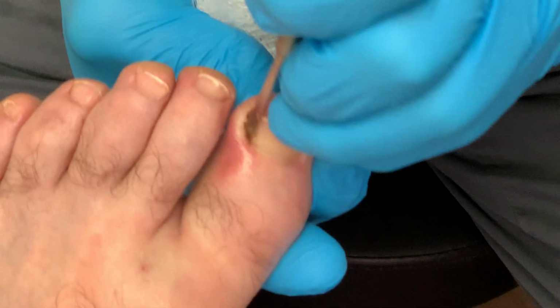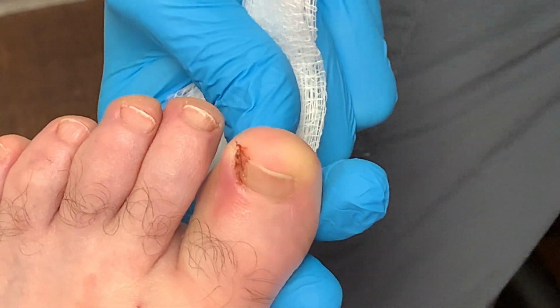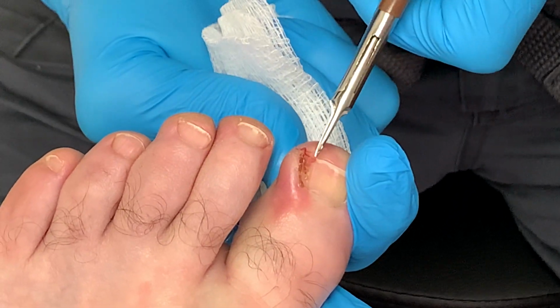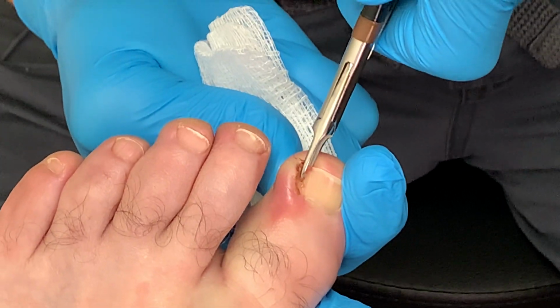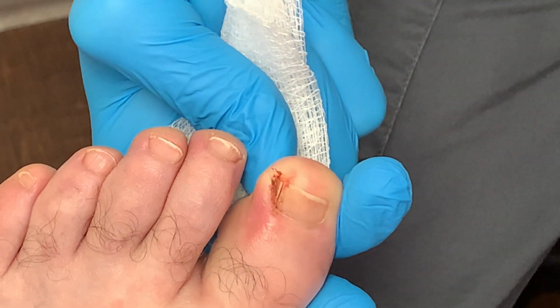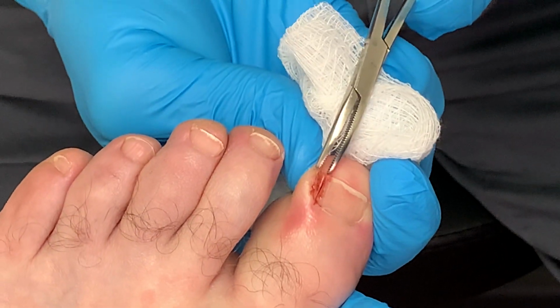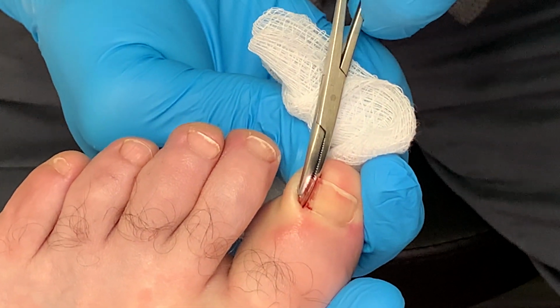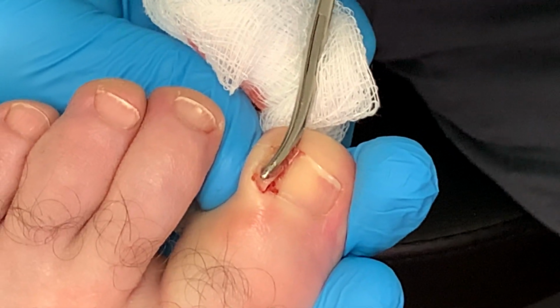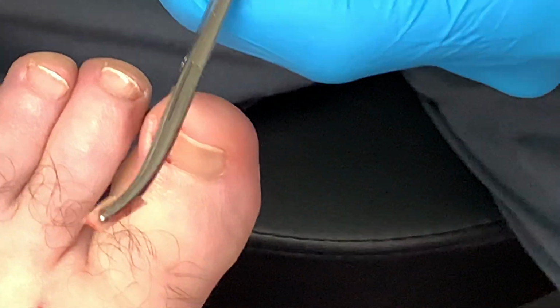So again, we'll just detach a little bit of the proximal nail fold. Go like that. Take our English anvil. Not a lot, just a little sliver there, all the way back. Snip. Take our little hemostat. All the way back. And this is what they were seeking. And it's a baby boy. Congratulations, it's a baby boy.